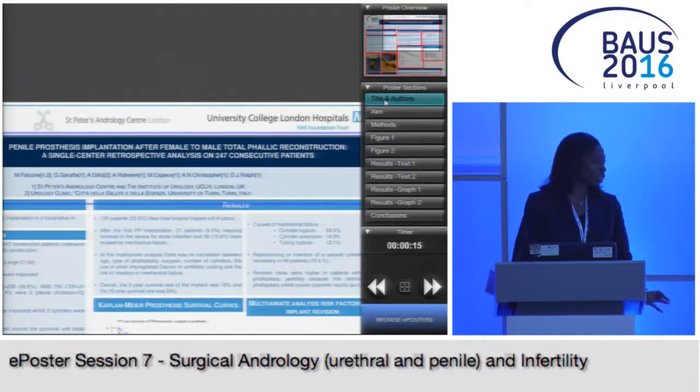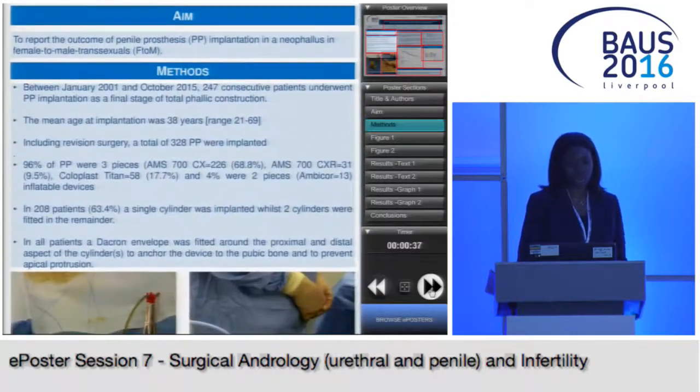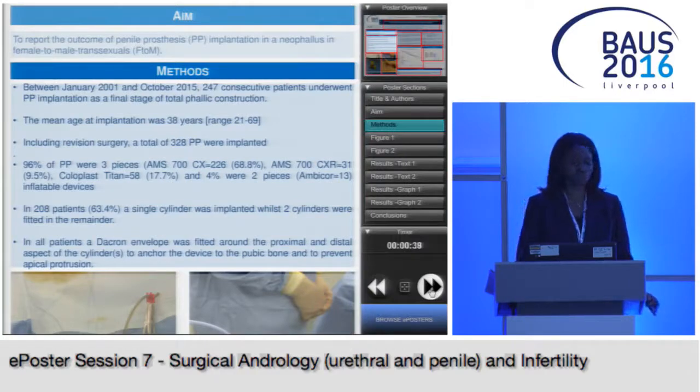I'm going to present our findings from penile prosthesis implantation following female-to-male phallic reconstruction. This tends to be the last stage of these patients' surgery, and it allows them to have both phallic turgidity as well as engage in sexual intercourse, which is usually very important for these patients. We identified 247 patients between 2001 and 2015. Approximately 63% of them had had a single cylinder implantation, with the rest having two cylinder implantations.